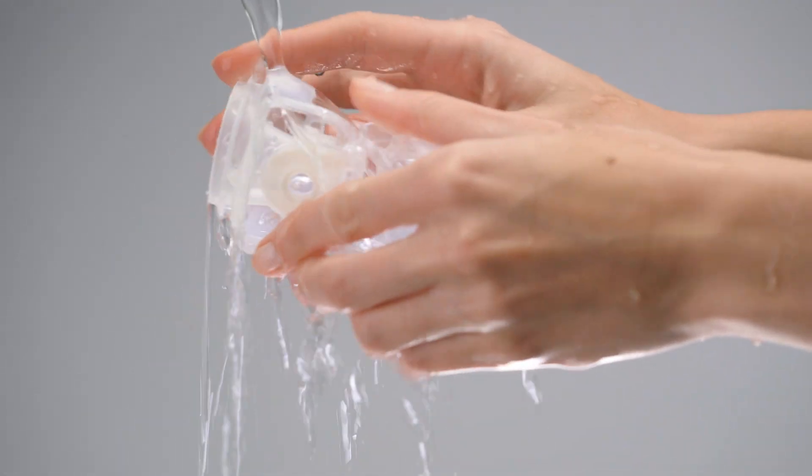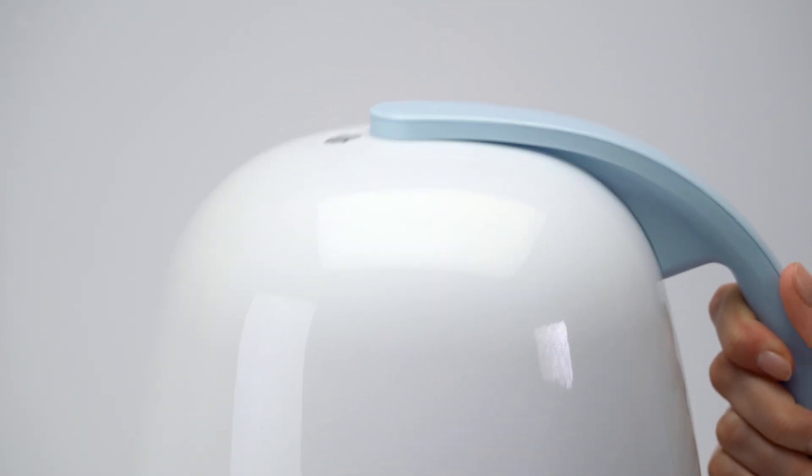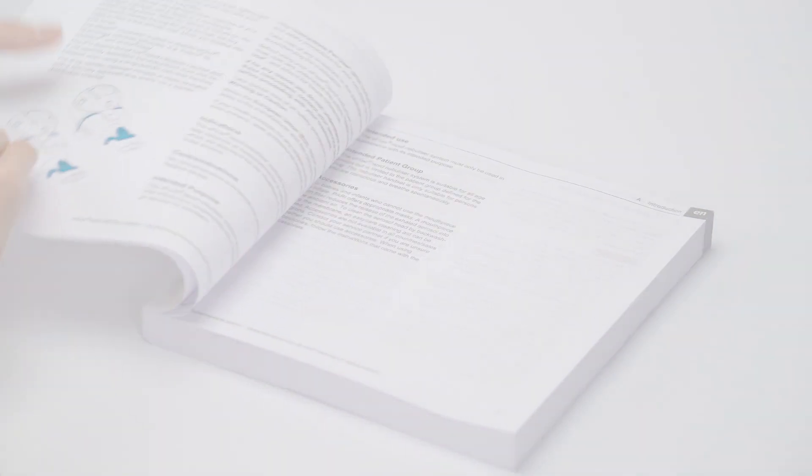Always clean the nebulizer immediately after each use and disinfect once a day. Please refer to the separate video on cleaning and disinfection, as well as the instructions for use.